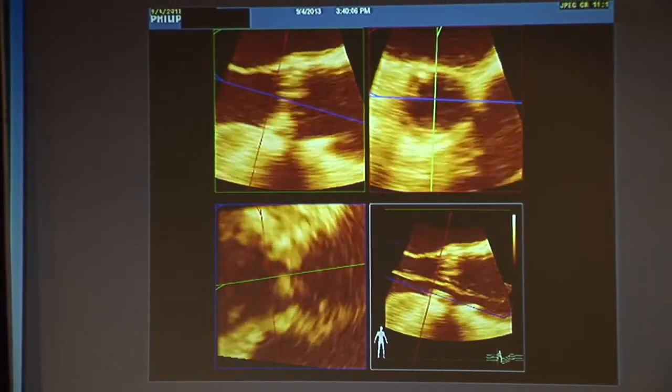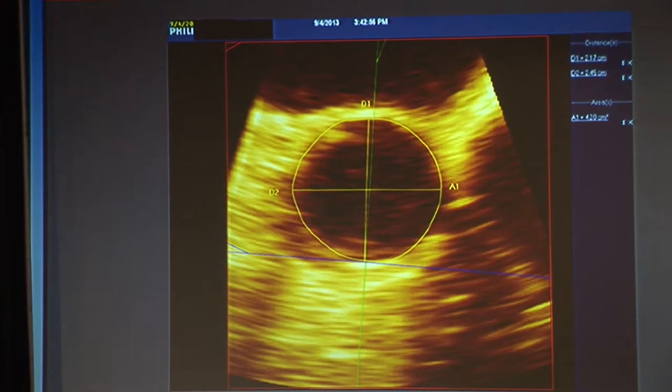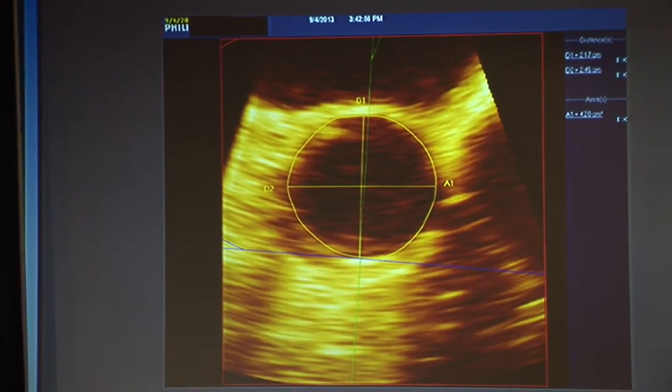We get nice three-dimensional pictures. We can break that up into planes very similar to the CT images. We can freeze that. We try to line it up with the bottom of the sinuses, which is a little more complicated than the CT one, and obviously the images aren't as pretty. We can measure an annulus there. And in a minute, I'm going to give you the list of all three together, so you don't have to read the little numbers on the screen.